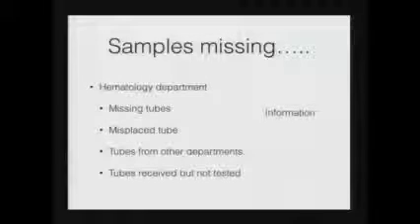I'm not sure, how many of you have faced this? Misplaced samples missing in a hematology lab? Looks like I'm the only one who's, oh no, I'm seeing some, yeah. Okay, so we come across this often.